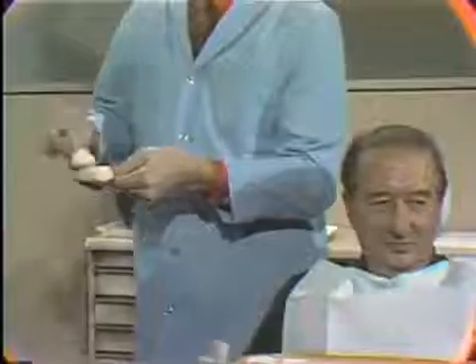After mixing the material until smooth, the tray is loaded. Notice that very little of the mix is placed in the tray. A small amount of material is first wiped into the labial vestibule to avoid trapping of air. A cement spatula can also be used.